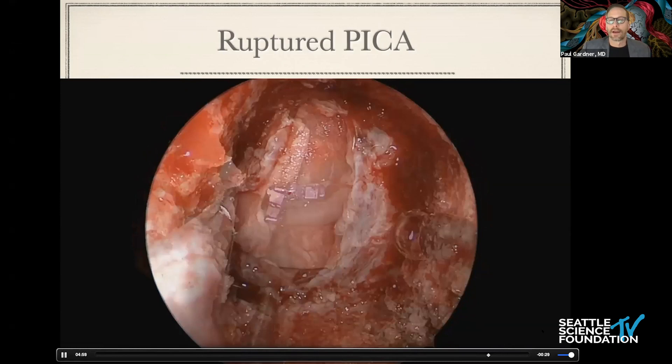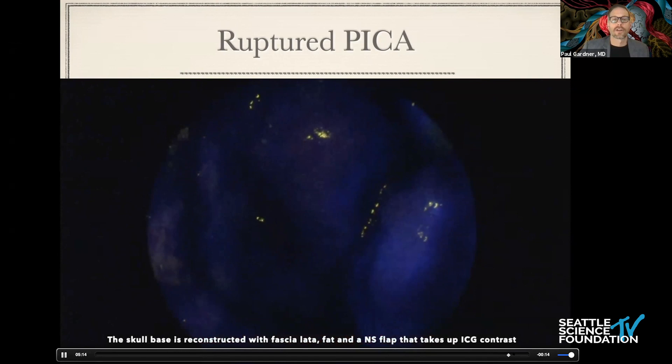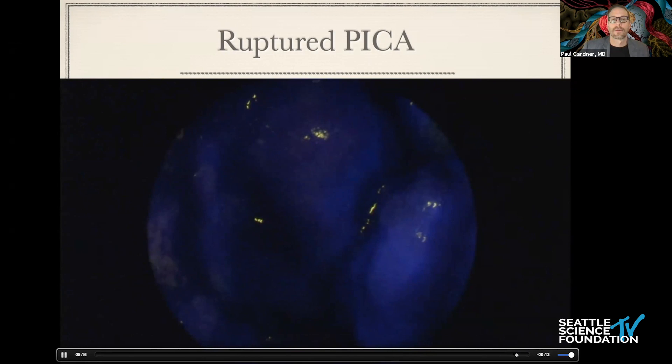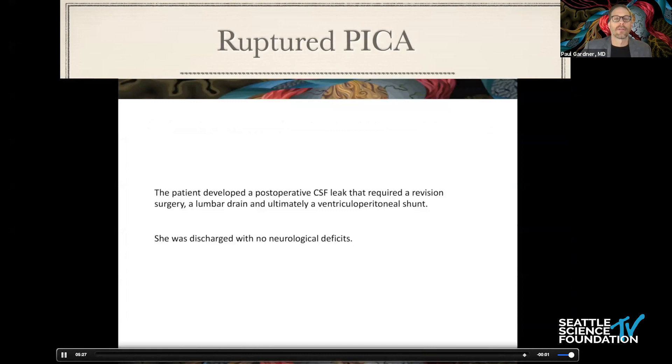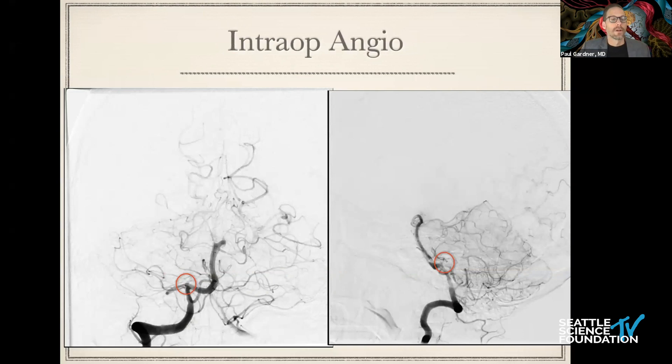There's our final view and a multi-layer reconstruction. The intraoperative and post-op imaging showing treatment of this aneurysm, although she did get a post-operative leak related to her hydrocephalus from the subarachnoid hemorrhage.